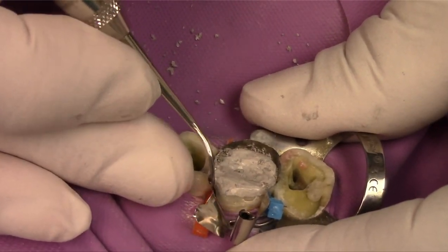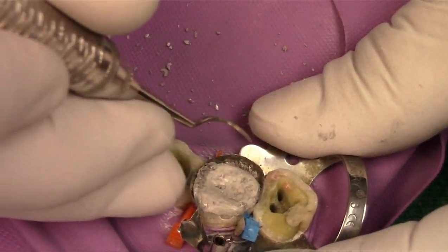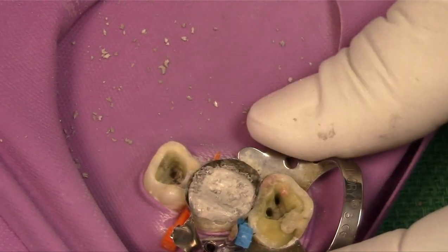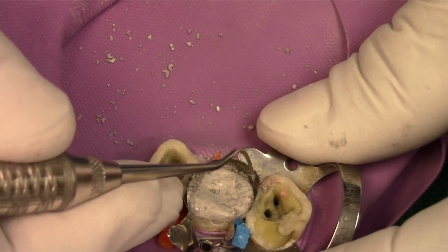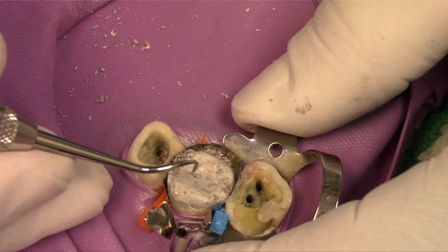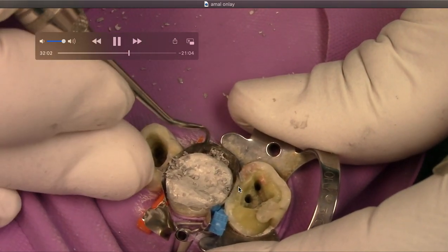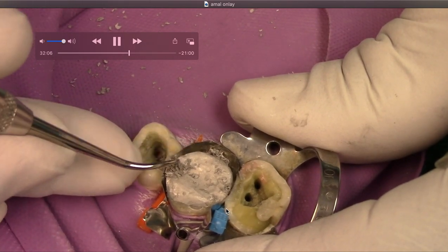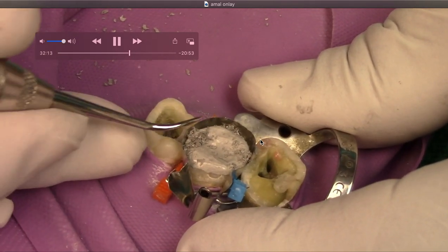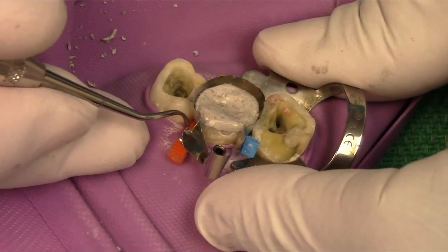I'm still carving away — the band is coming off soon. The tooth is slowly getting loosened. I can't stress it enough: contour the gingiva, contour everything you can't get to before this thing hardens. The occlusion you can easily fix with a bur. If there's a restoration on the adjacent tooth with bad contour, I would re-contour it or pack a new one or place some flowable just to get a better contour. That will help you get a better contact. It's taken me about 20 years to figure out the true importance of contact.